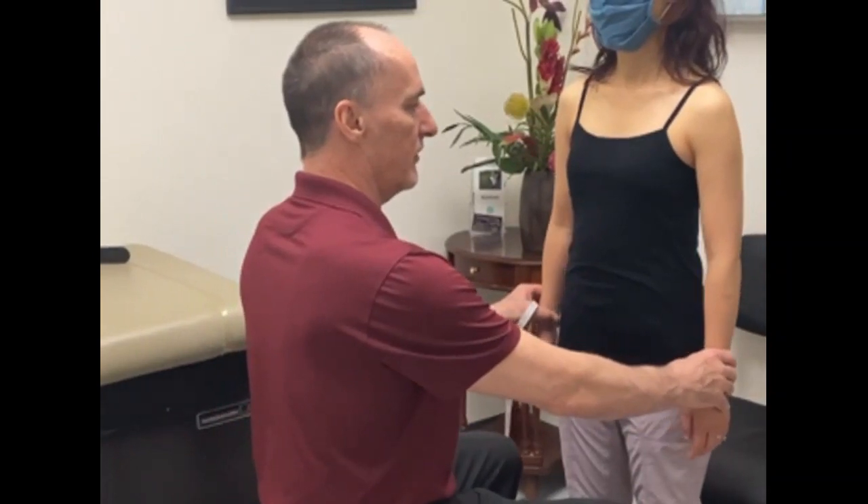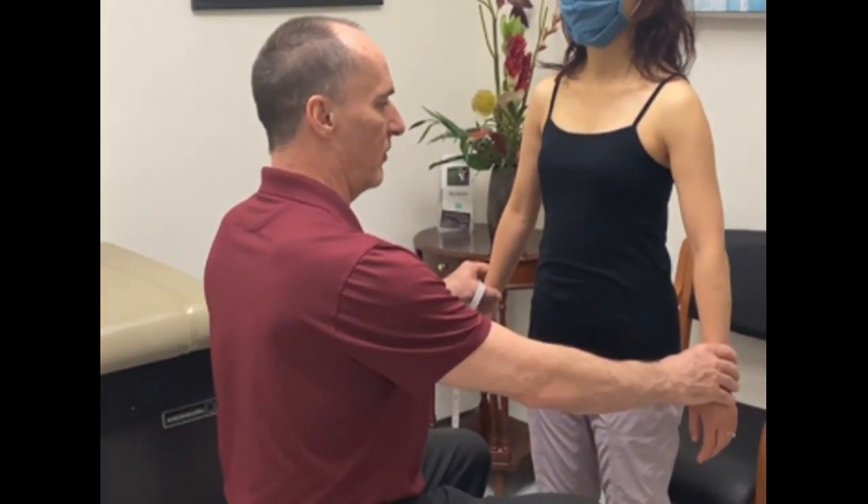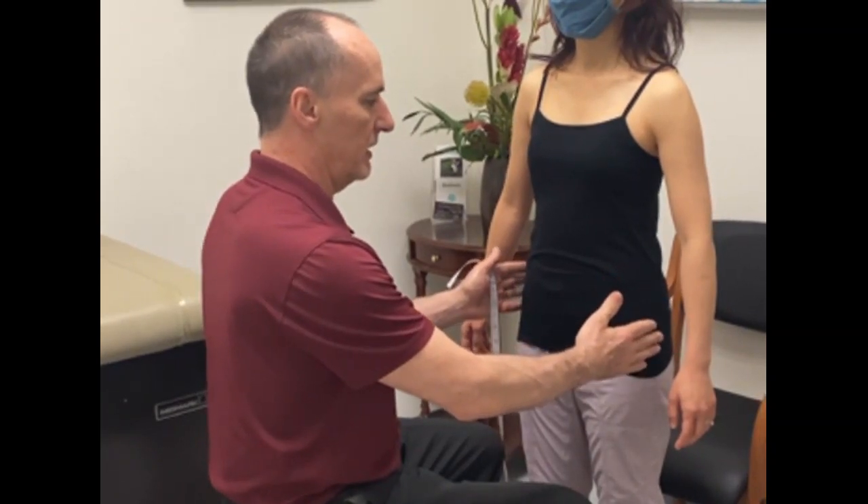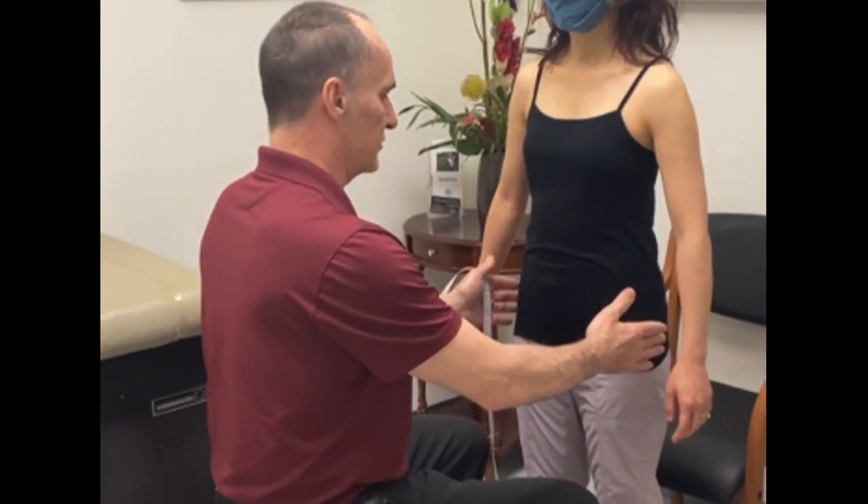This is the LA Brace training video showing how to correctly take measurements for the LA 3D brace. Have your client standing in front of you, have them move their arms slightly away from the body, and make sure they're wearing a snug-fitting shirt. Then start with the tape measurement.